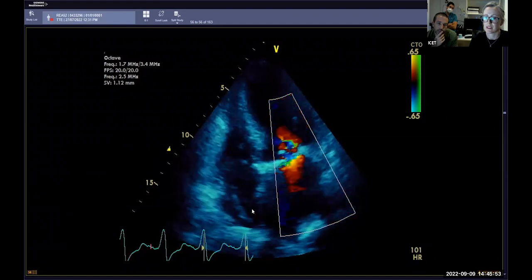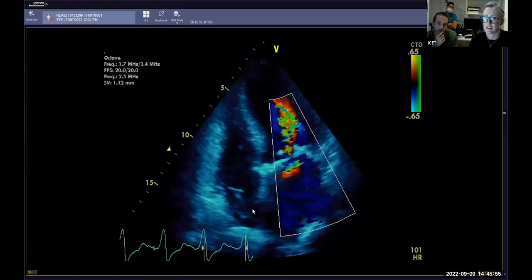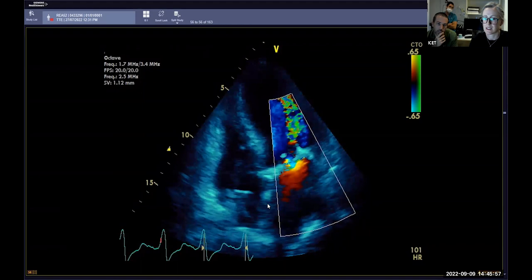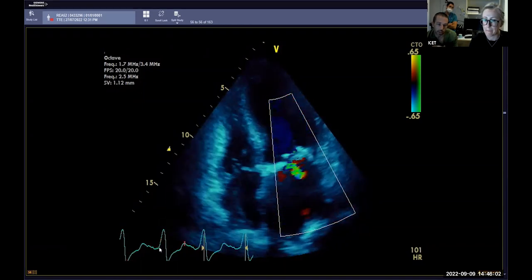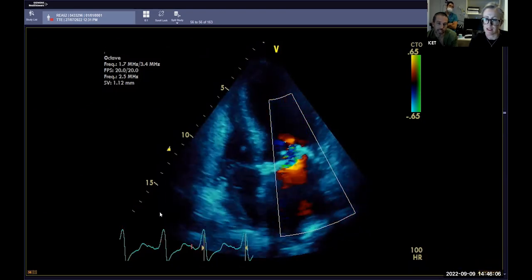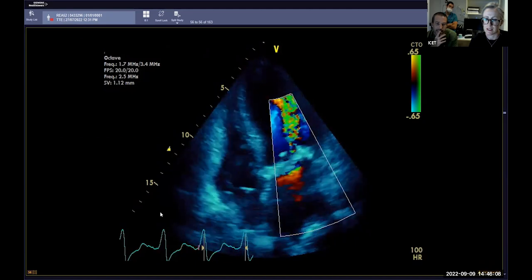I mean, I'm underestimating it here. There's a bit of splay by the look of it as well. If you just slow it down, I think they'd appreciate that more. There are numbers, and I've forgotten them now, but if you're going to slow it all down, interrogate for PISA and angle correct and all those things.